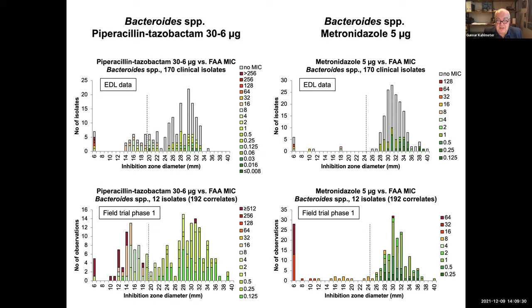And we will ask them for the strains that we find especially interesting so that Cardiff and Trevor and Sarah can do MICs with agar dilution on these, and we can pitch those into these distributions to enrich the distributions that you're now looking at. In this way, we will learn a lot, the participants will learn a lot, and the system will be enriched. Does that answer your questions? Yes. Thank you. Anyone else?